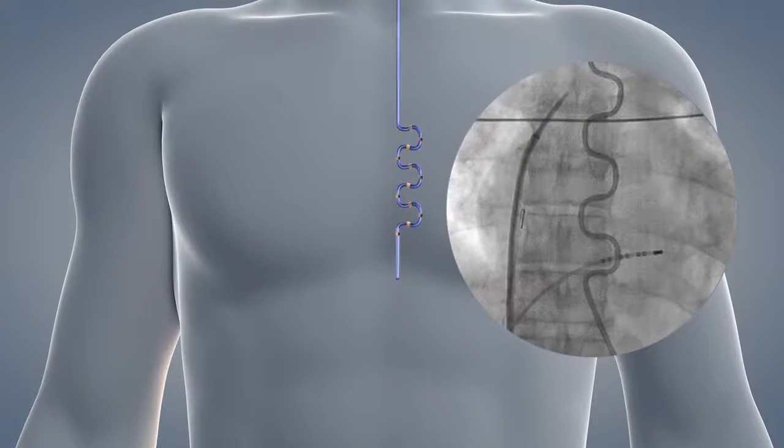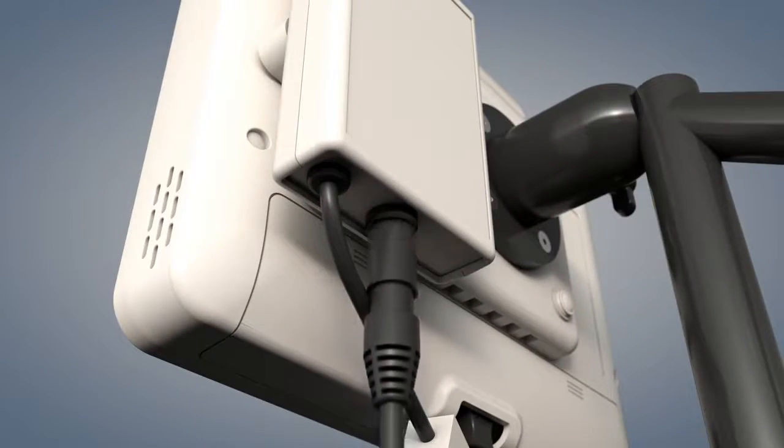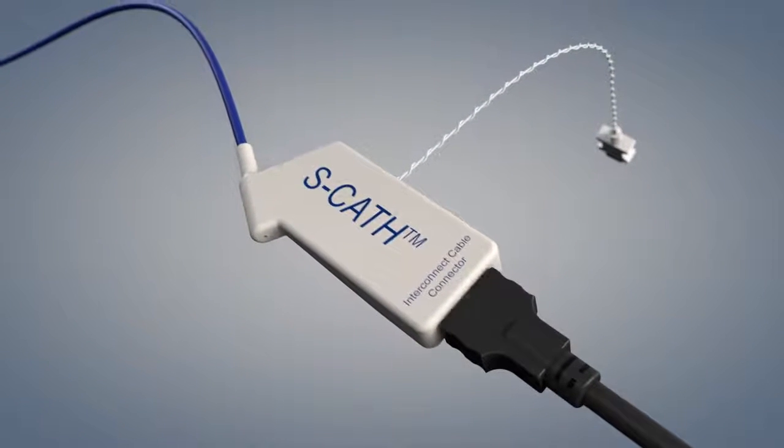Once the probe is properly positioned, connect the CERCA interconnect cable to the CERCA monitor, then connect the probe to the cable. Secure the cable to prevent movement of the probe. You may also connect the 400 series connector to your own core body temperature monitoring system.